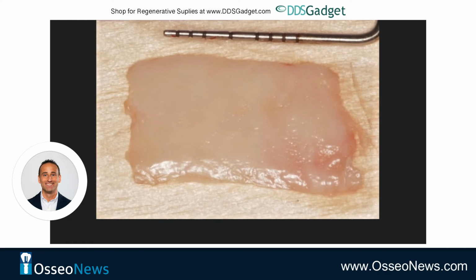Here's a picture of the tissue graft. It's important to realize that these grafts really go through a lot of shrinkage. There's primary shrinkage, which is when you take it right off the palate and the whole thing starts to contract. And then there's secondary shrinkage that occurs when the graft is healing. So, we used to have a joke in residency that whatever you think you're going to need, take double. So you got to make sure that if you're going to harvest and you're putting the patient through this anyway, make it count.